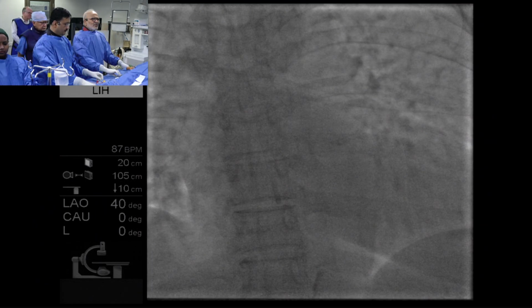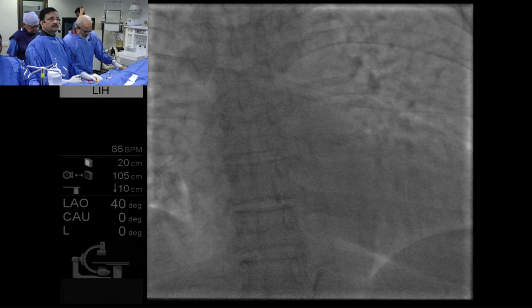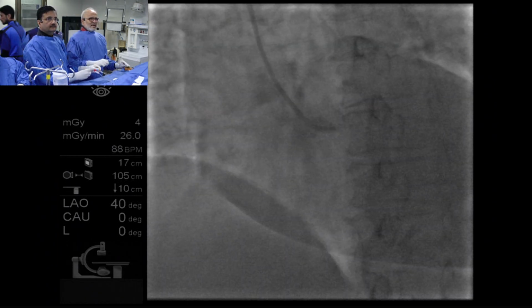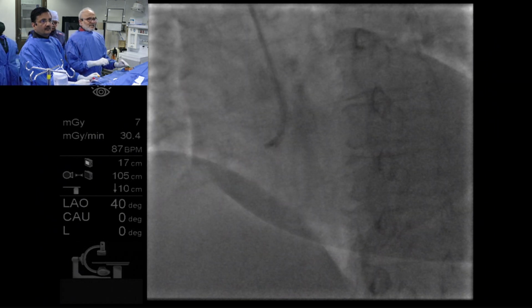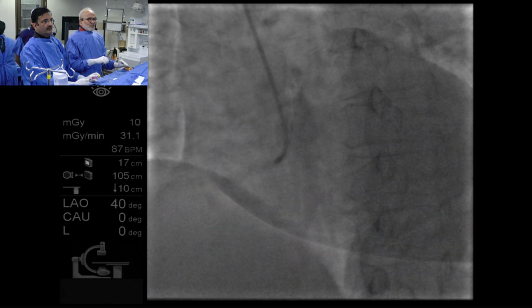So we always give them a chance of cath lab intervention to start with, and with imaging, we are able to achieve a reasonably good minimal stent area, and in that case, the event rate also is quite substantially under control. So we give this, and we are used to it.